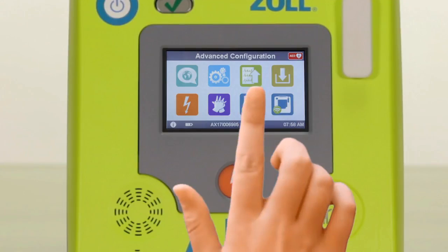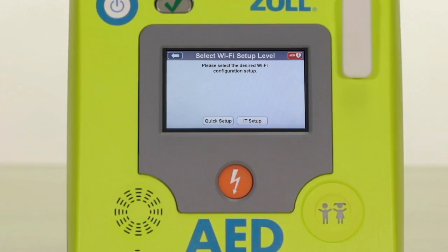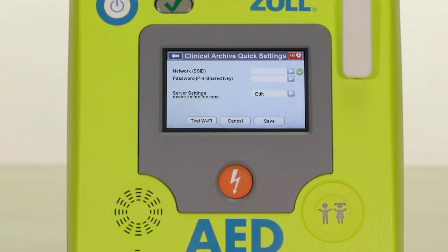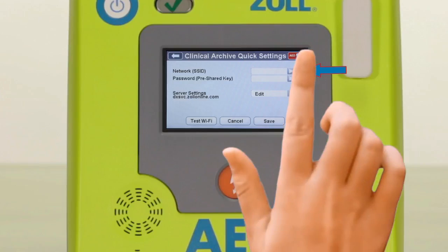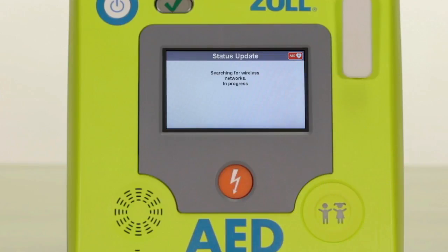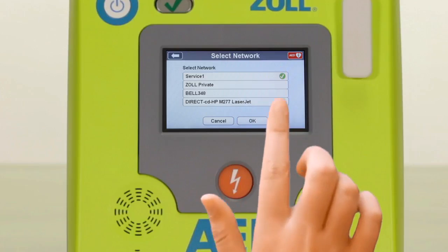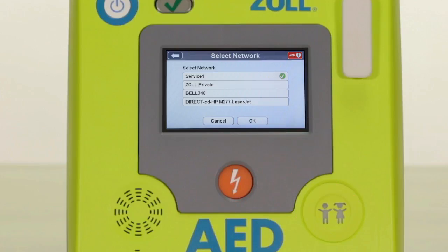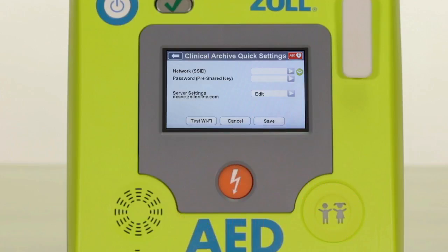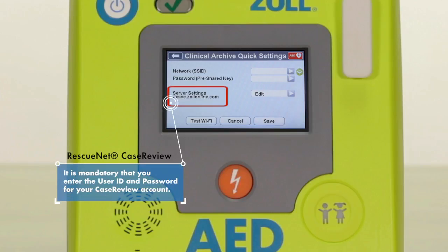Similar to setting up your cell phone or laptop to a Wi-Fi network, you can select the quick setup, find an available network by pressing the green Wi-Fi icon on the top right of the screen, select the network, click OK, then enter the password in the screen that appears. The server settings portion of this screen should not be altered — this is the IP address that the data will be transmitted to. The default setting is for case review and transmits data to your case review account through ZOL data.